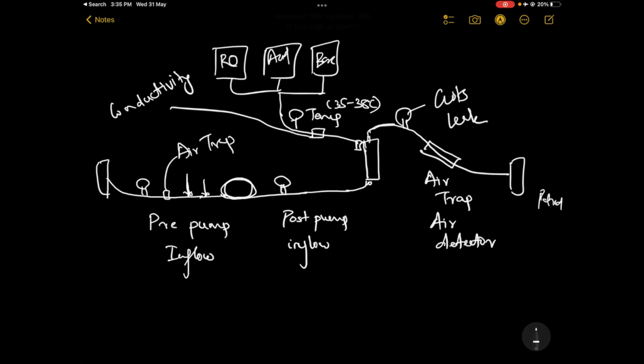Okay, then from that the blood flow and dialysate go in the opposite direction, and the ultrafiltrate goes into the drain. This is your ultrafiltrate. So this is basically a schematic diagram, just a basic idea of how the dialysis machine works.